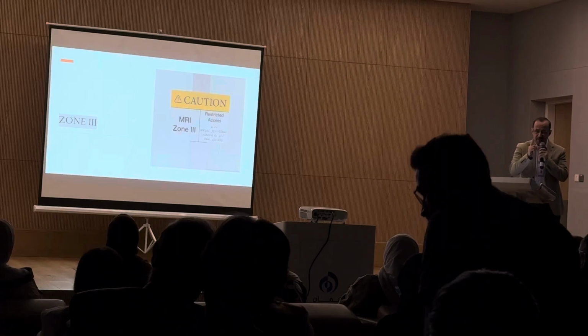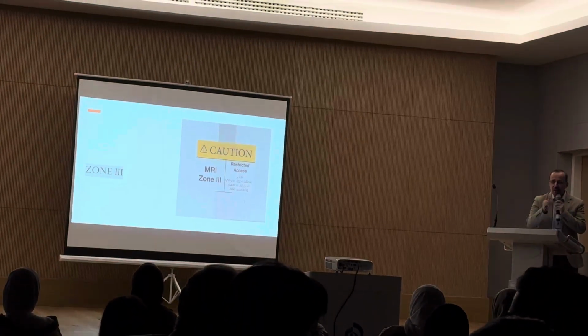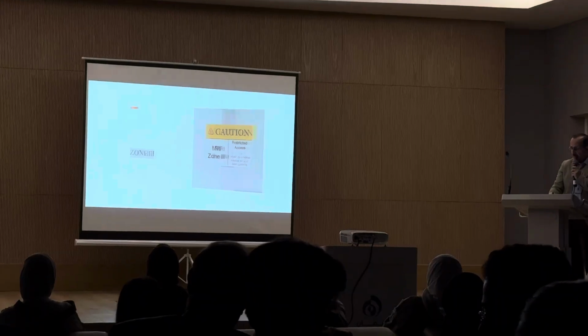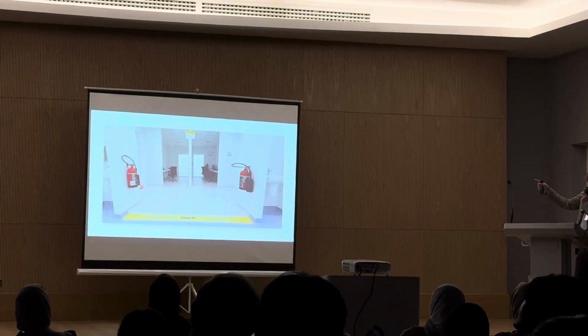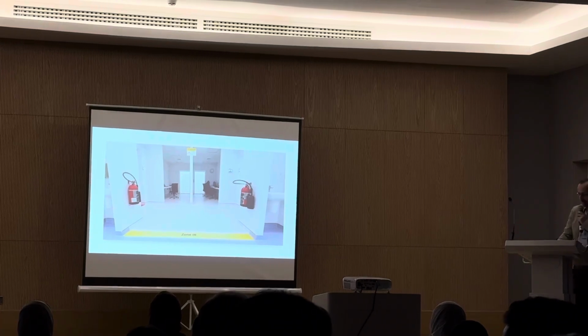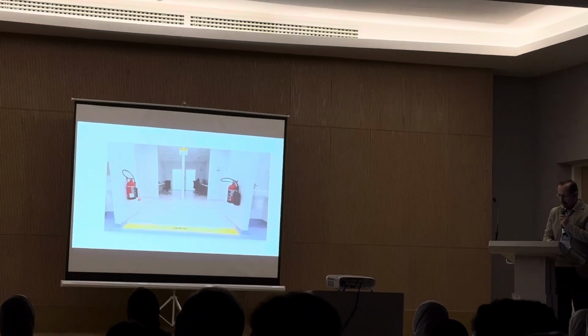I emphasize this point. He should know how to deal with MRI emergencies. And in this zone, we have our extinguishers, we have our control room, we have our free exit, and the door to the MRI room, which is zone 4.